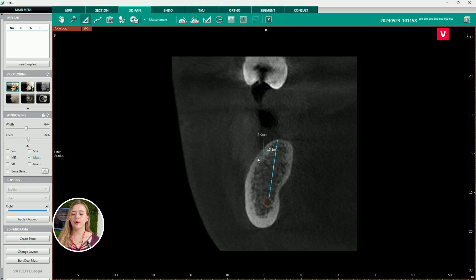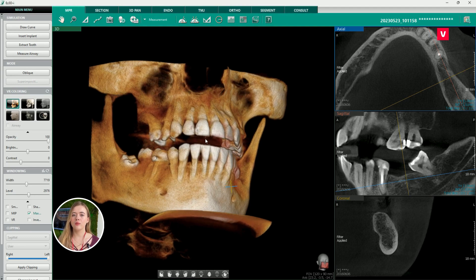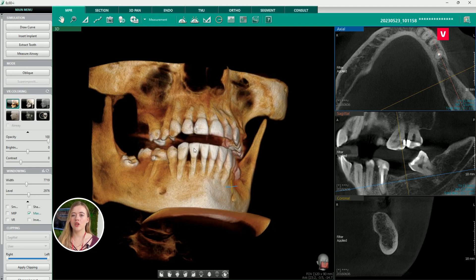By using all the previously mentioned tools, you can easily plan an implant and its size, determine if the patient is suitable for the implantation, and make sure there will be no complications.